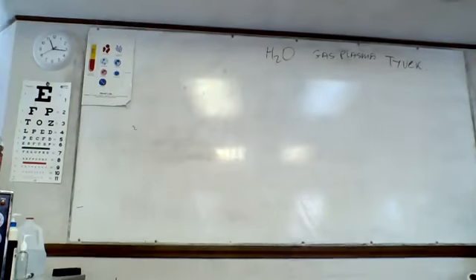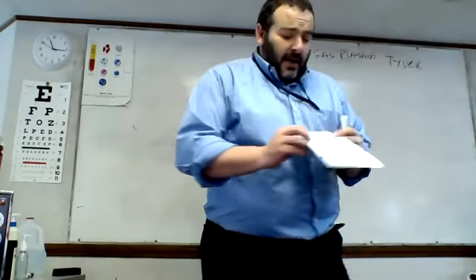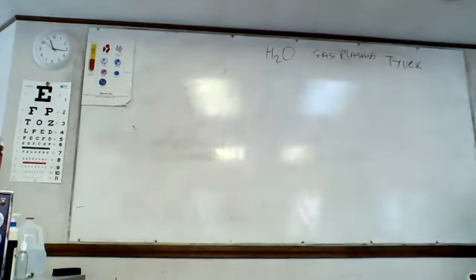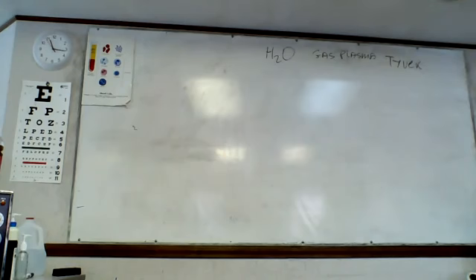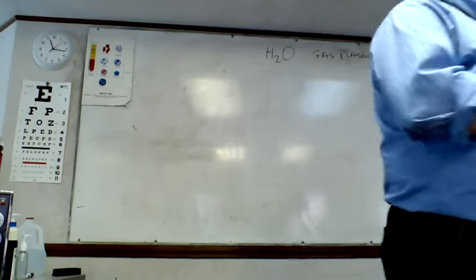But if I show you here, one second. Check this out, right? Watch this. This is a peel package, right? And if I show you this peel package here, it says two chemical indicators: steam or EO gas. They marked it as EO. It's ETO or EO. It's one and the same. So ethylene oxide on this side, steam on this side. So whatever it's exposed to, don't just think it's heat. It's the actual chemical.